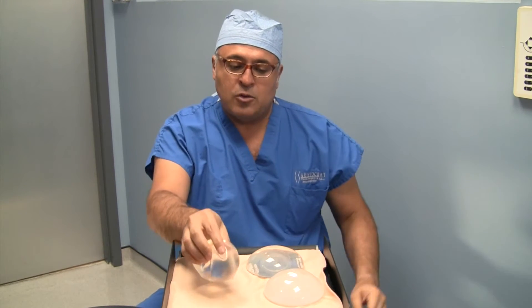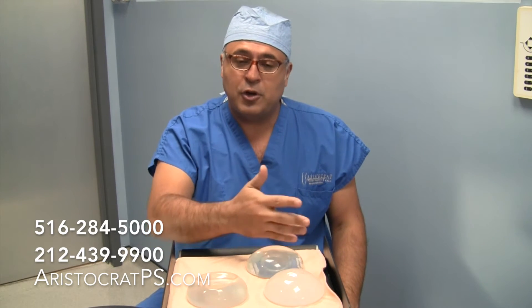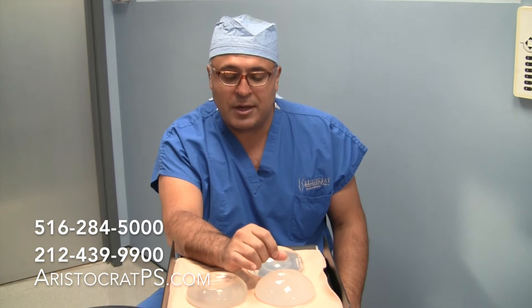For patients that don't feel silicone implants are safe — and I must say that silicone implants are very safe, and even if you cut them they don't leak anymore — this is a new alternative, and those patients can have this new Ideal Implant.